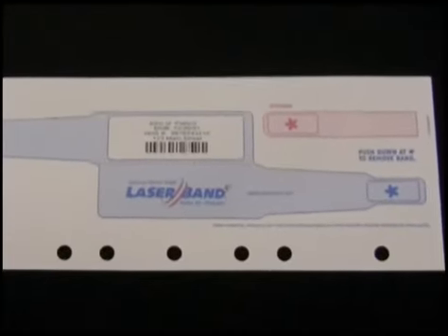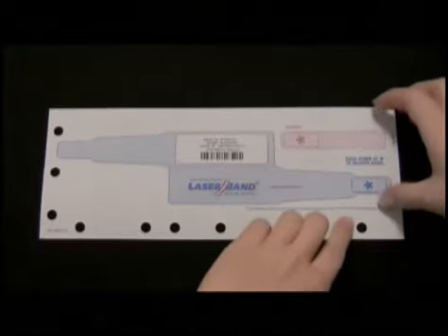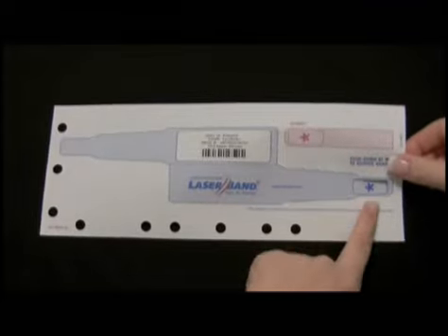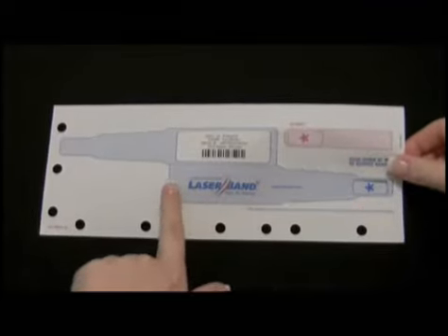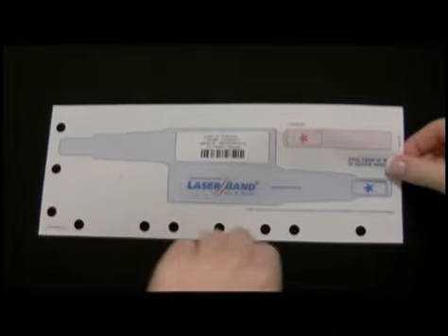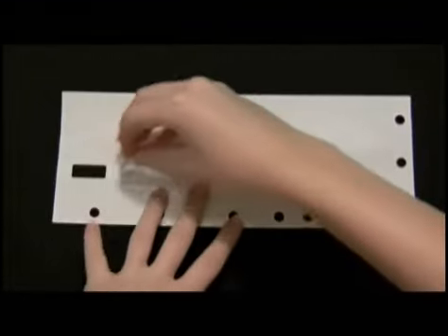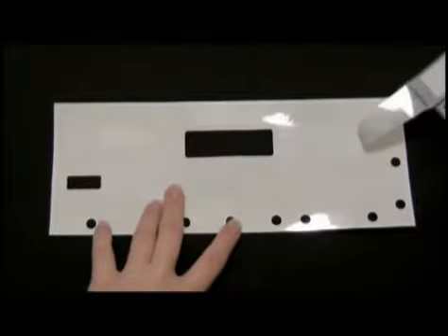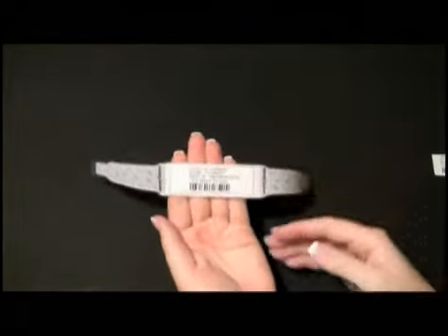Begin by assembling the L3S wristband. Locate the large blue asterisk on the wristband. Hold the carrier sheet firmly as you punch through at the asterisk. Be careful not to hold the form where it is shaded, as this indicates where the wristband is attached to the back of the form. Once you have punched through, turn the form over and begin pulling the wristband away at an angle. This is to ensure the laminate window remains attached to the image area as you remove the band from the form.